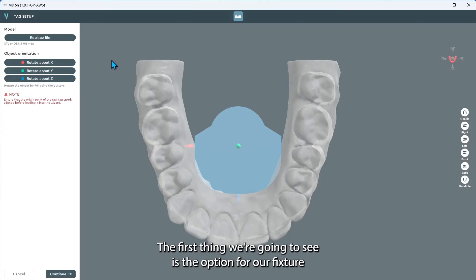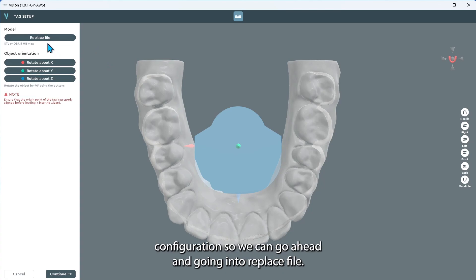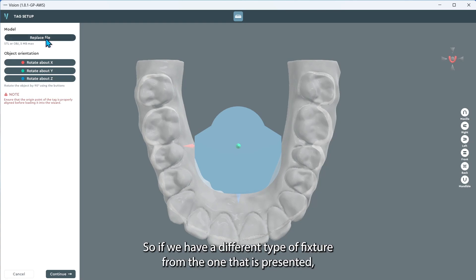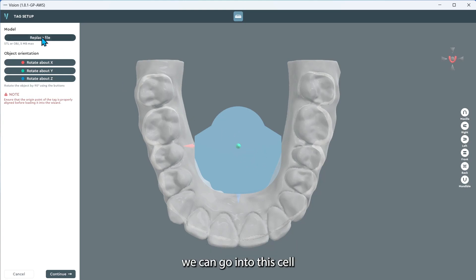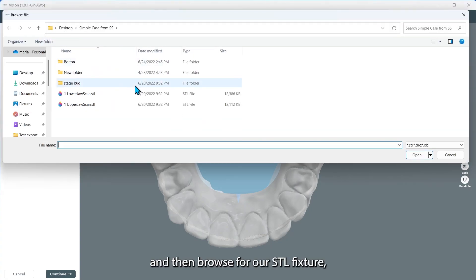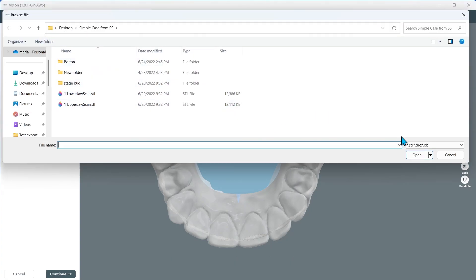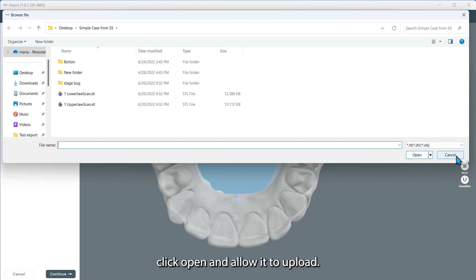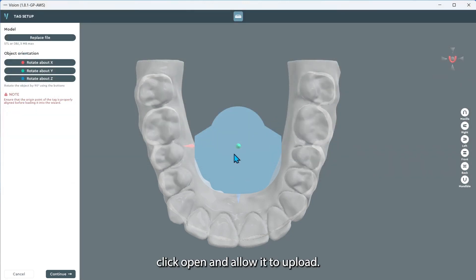The first thing we're going to see is the option for our fixture configuration. We can go into replace file. If we have a different type of fixture from the one that is presented, we can go into this cell and then browse for our STL fixture. Click open and allow it to upload.